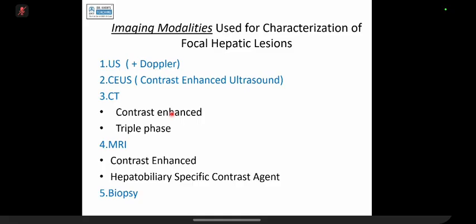I remember when I joined radiology, in the first book which I read, they said that for hemangioma, you can scan the patient periodically for 35 minutes. So, wow, 35 minutes, radiation, you are roasting the patient. So now we have got MR.